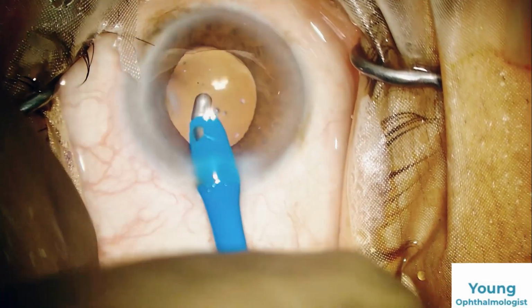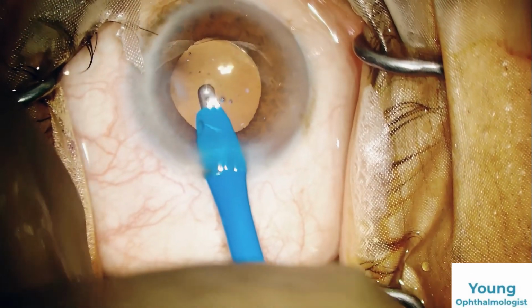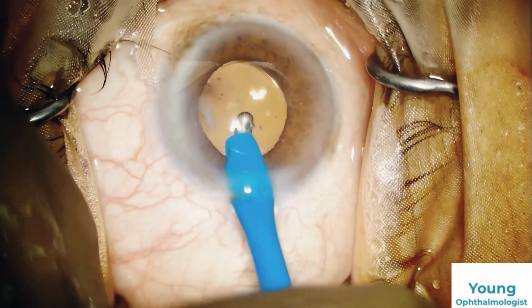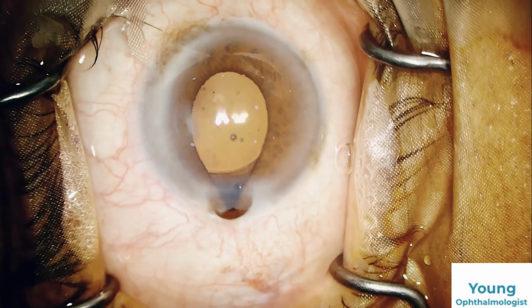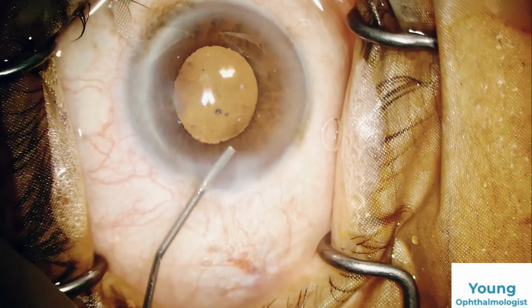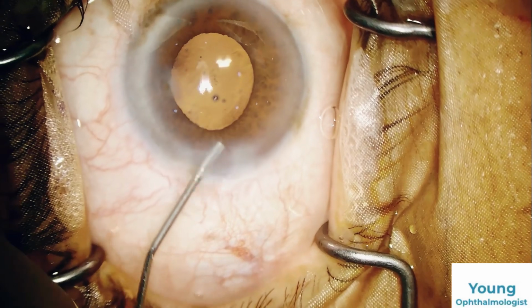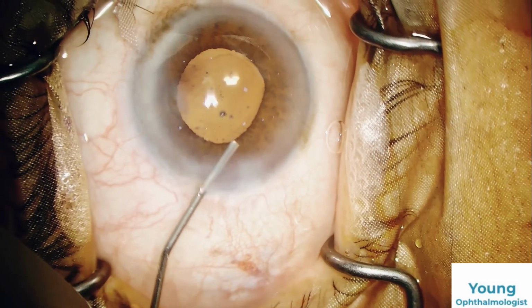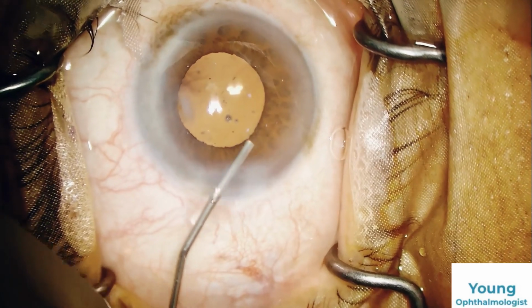I use Alcon BSS in all my cases. For the iris prolapse, after I remove the coaxial, you can reposit it slowly with strokes. Doing some AC lavage with the BSS.